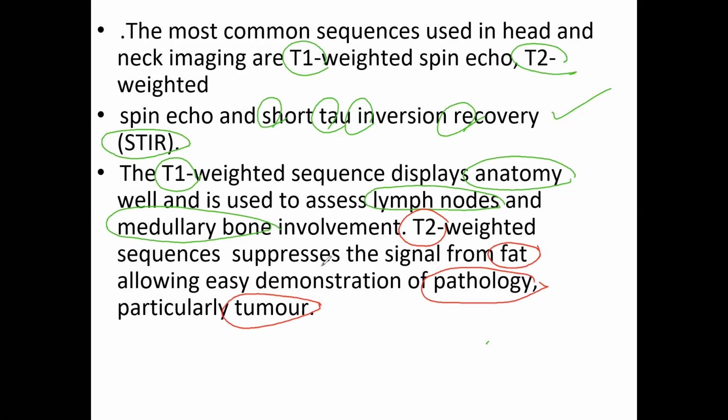So keep in mind: T1 is anatomy, anatomy, anatomy, especially lymph nodes and medullary bone. T2 is pathology, pathology, pathology.